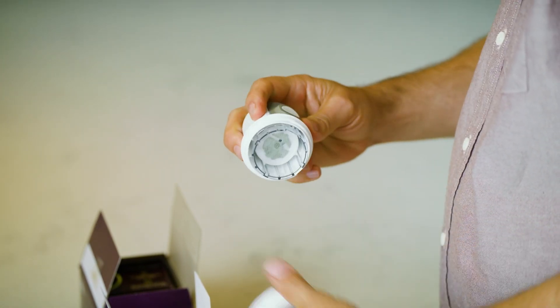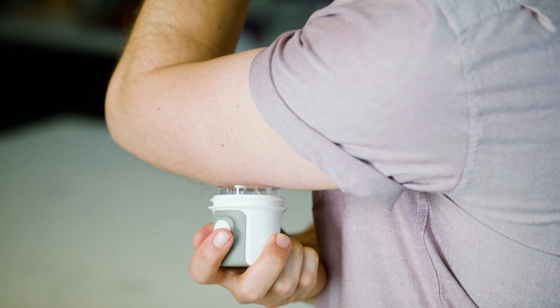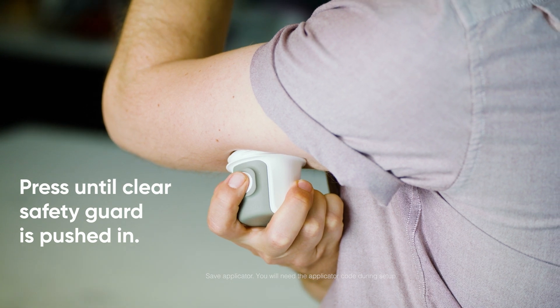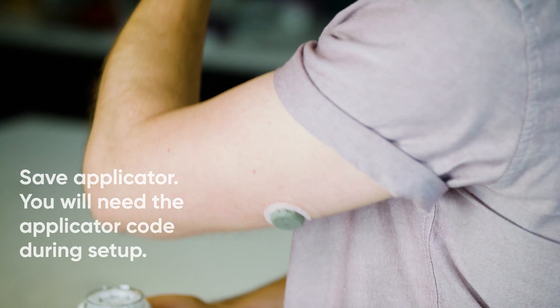Then, grab your applicator and unscrew the cap. Do not touch inside the applicator. Press and hold the applicator firmly against your skin until the clear safety guard is pushed in. Now, press the button and remove the applicator.